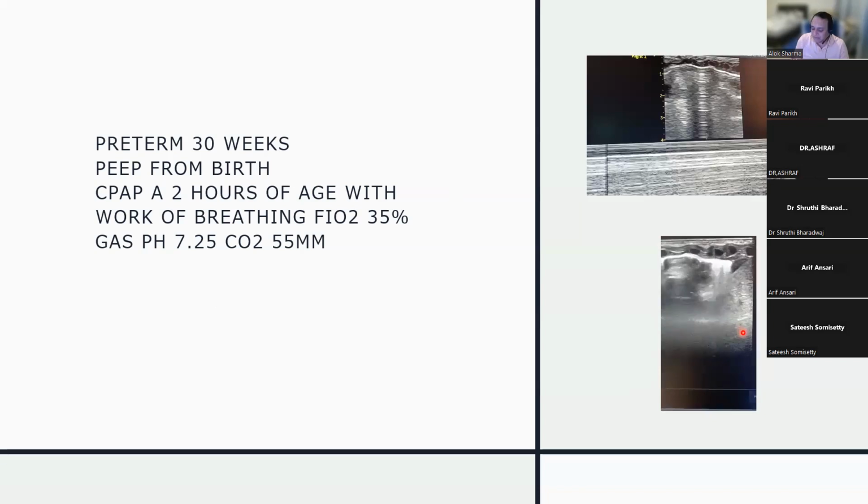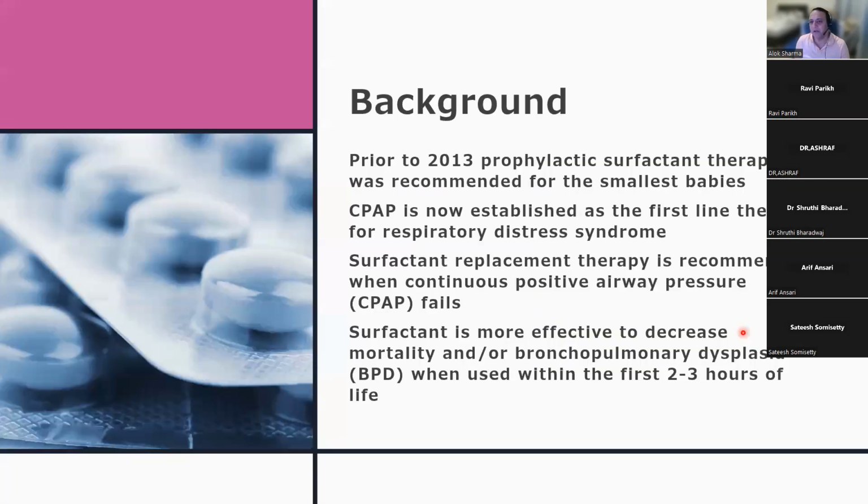So again, I'm just giving you a flavor of how important lung ultrasound is and how helpful it can be in these circumstances. Now you can get an X-ray, and that would help you just as much to make the diagnosis as well. So you can make a diagnosis with both, but for units who might have radiology coming off-site, taking time, it might take a long time before you can actually treat this baby with the best treatment that you think is possible.